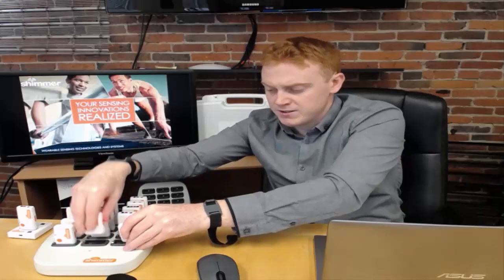So my two units are now ready to start collecting data. Firstly, I'm going to undock the units from the Consensys base. As I mentioned, with the undock-dock method, these units are now collecting data to the Shimmer's inbuilt SD card. This is verified by the flashing green LED on the units. The LEDs on the Shimmer units indicate what state they are in.